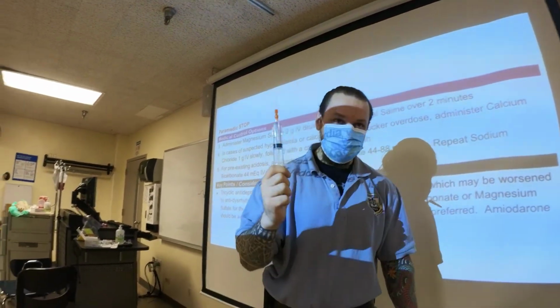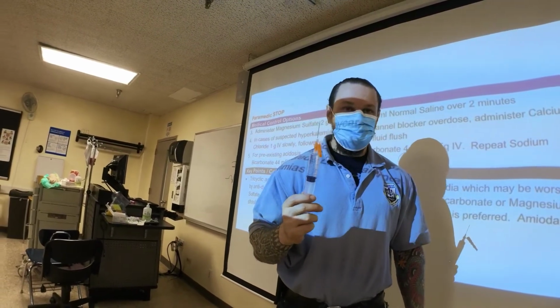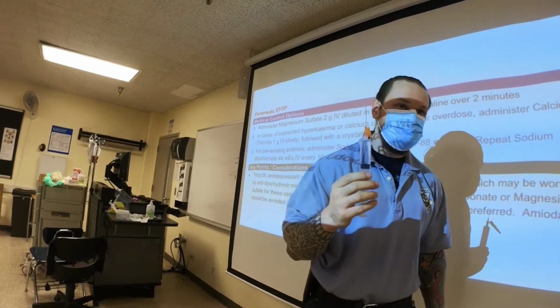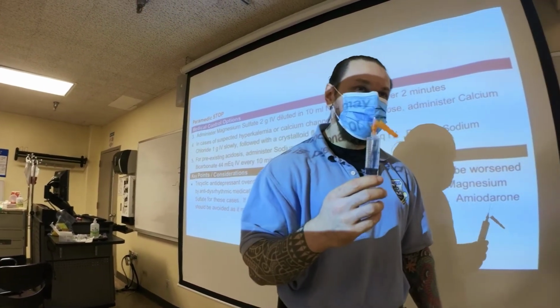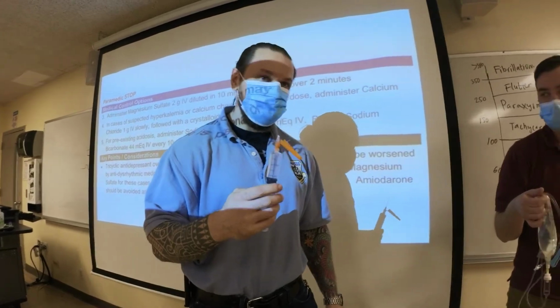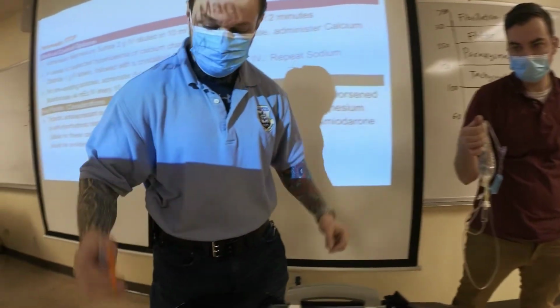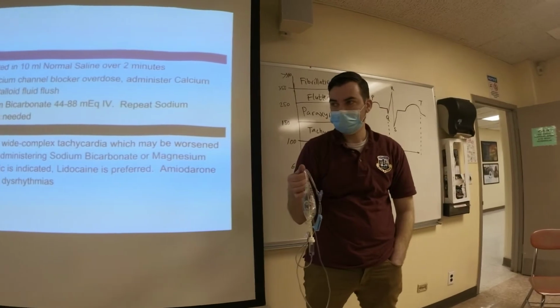So now I have mag here, right? Now don't go away, Georgie. So what's the next step? You're going to label it. Not necessarily. If I was going to do a drip, I could. For this one, I don't necessarily need to label it, because I'm going to give the whole amount right now. Confirm with your partner. Yes, we have confirmed it. So what is the next step? Secure the sharp. Kink the line. All right. So here's my sharp.